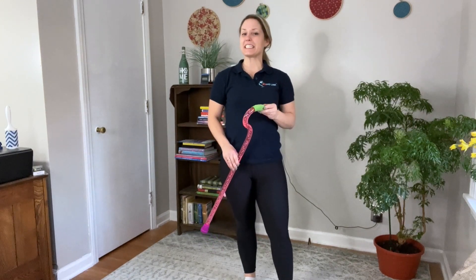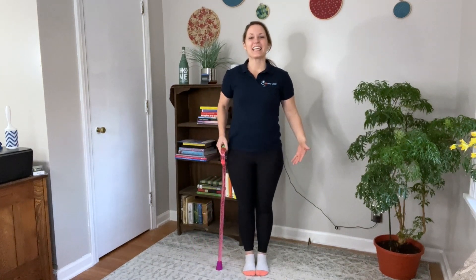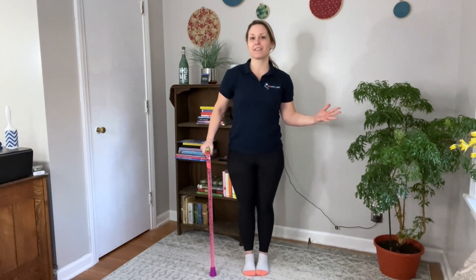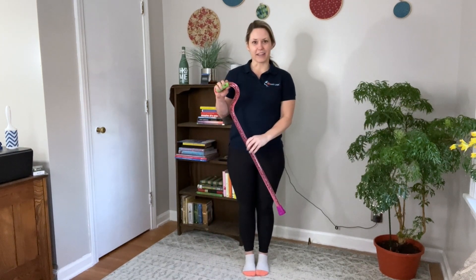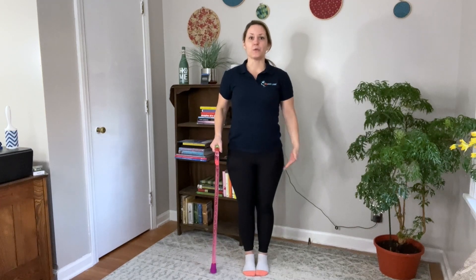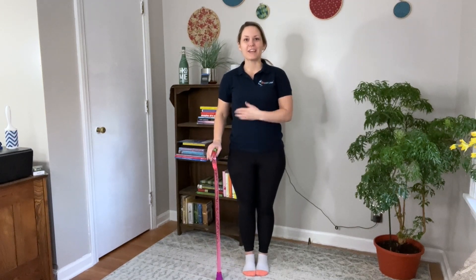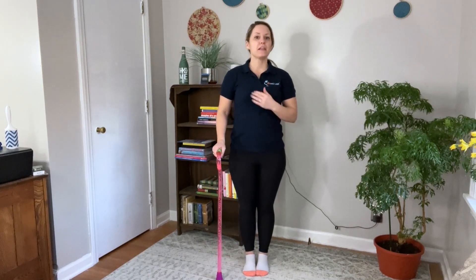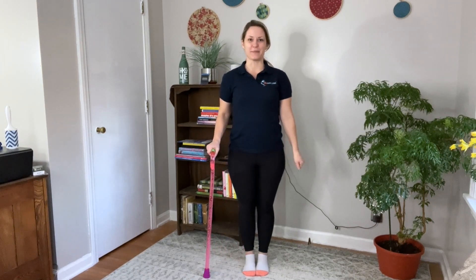One thing to consider is if you will be wearing shoes or not while using your walking stick. If you'll be wearing shoes more than 50% of the time that you're using your walking stick, then please wear shoes while you are measuring. But if you will not be wearing shoes, then please do not have shoes on while you're taking the measurements.